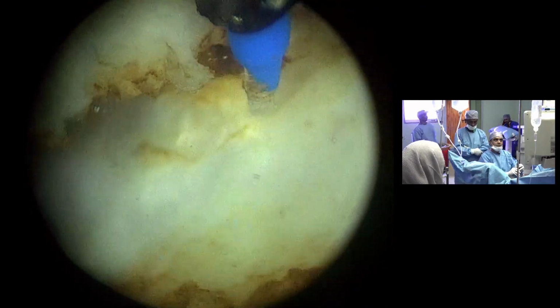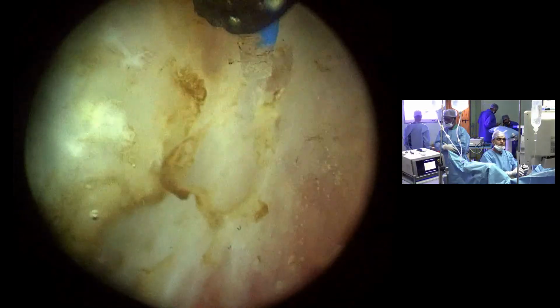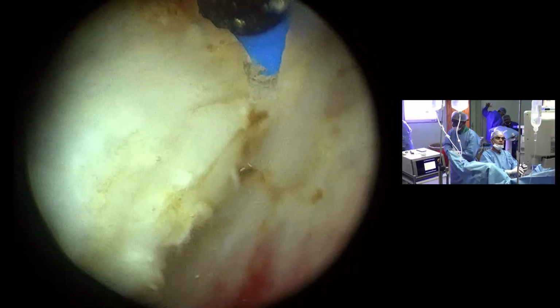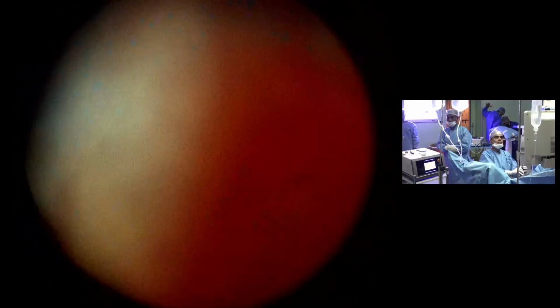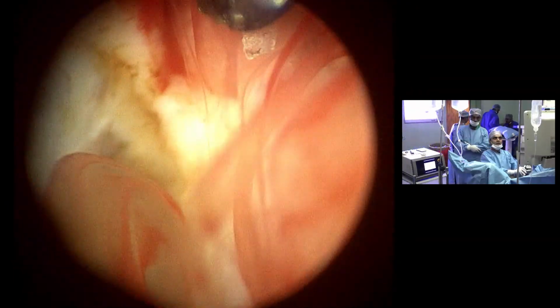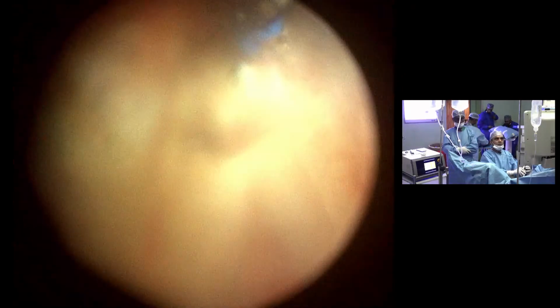Thank you, sir. Just for the sake of discussion, would like to have your opinion about the green light laser in this contemporary era with specific indications. What is the role? Is there any role, or has thulium just replaced it? So green light laser per se can be used, but it has not been popular in India because of the cost.